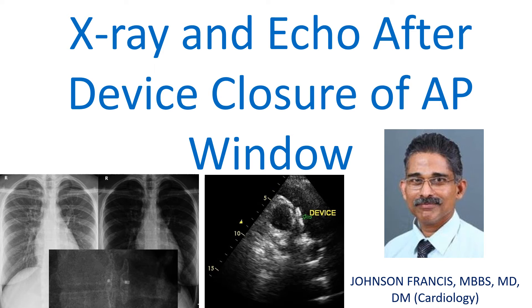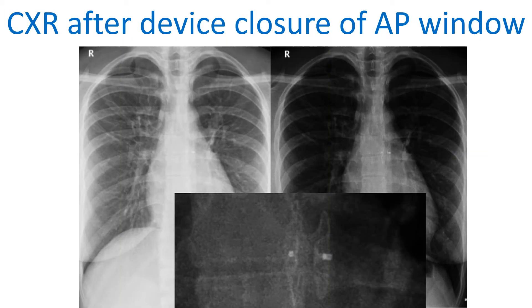Rare X-ray and echo images after device closure of an aortopulmonary window. Device closing an aortopulmonary window is seen on chest X-ray PA view in different styles. The first upper panel shows a standard PA view with the device faintly seen to the left of the spine, medial to the left cardiac border.